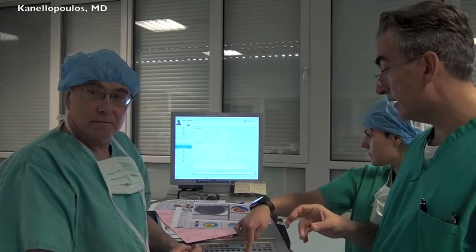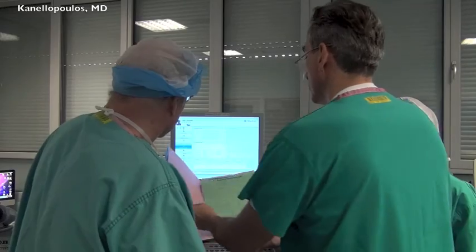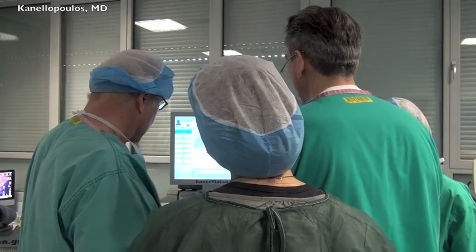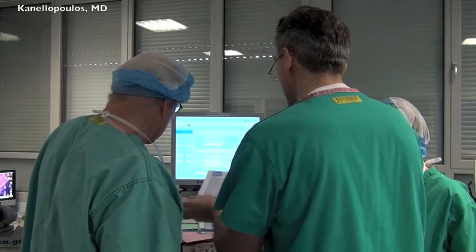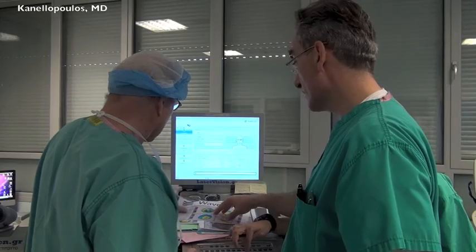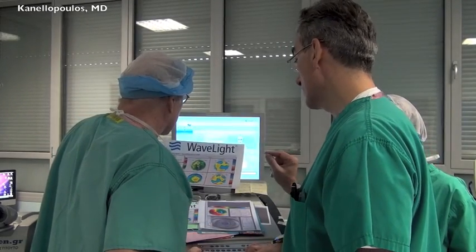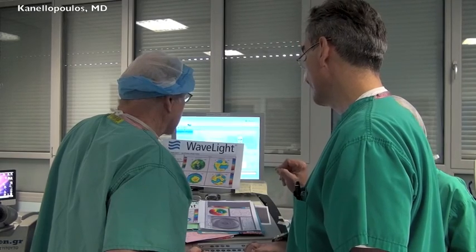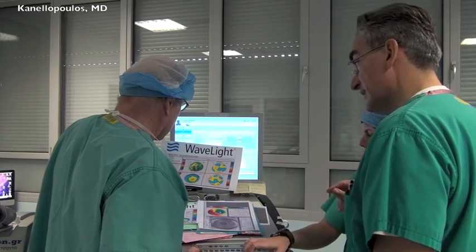So let's have Dr. Waring design the next patient. You're on your own. This is a very interesting case because this case is not keratoconus. This is a cornea scar. So here we have to use placido disc because pentacam is kind of blind to cornea scars.